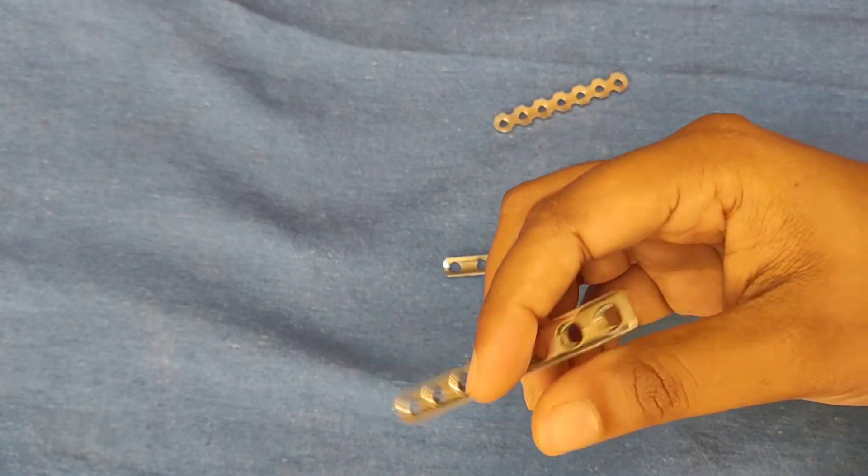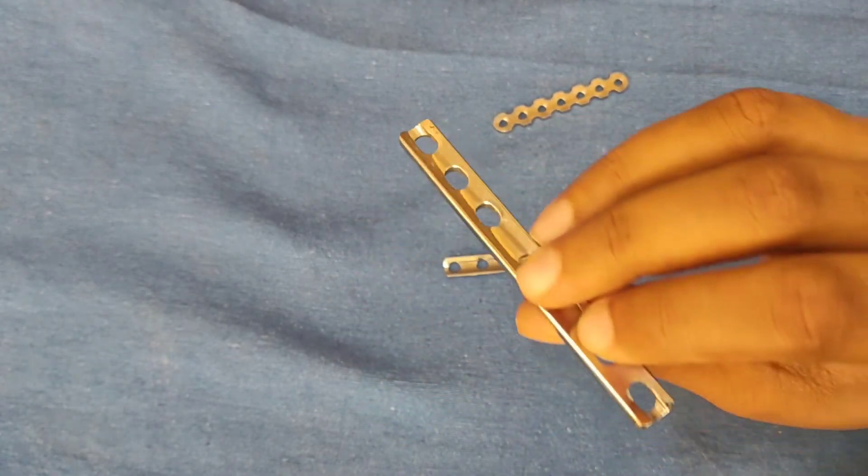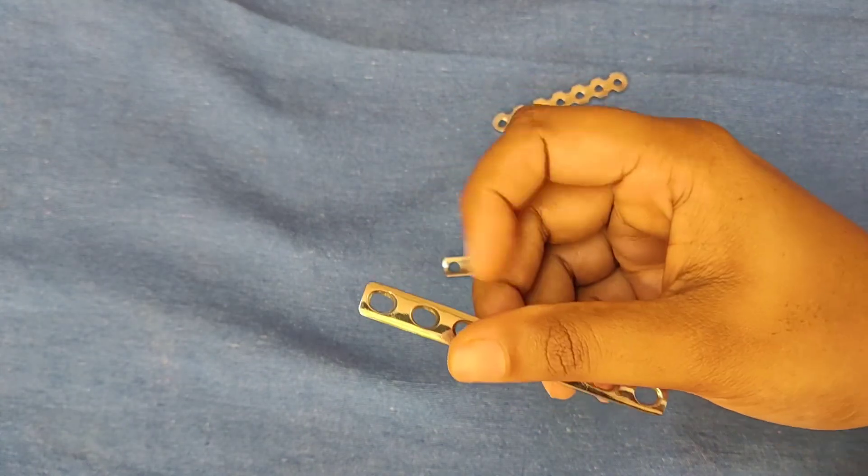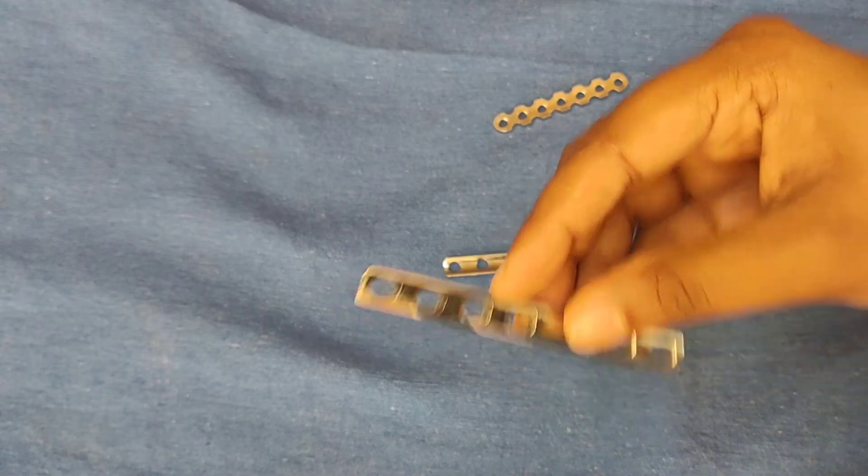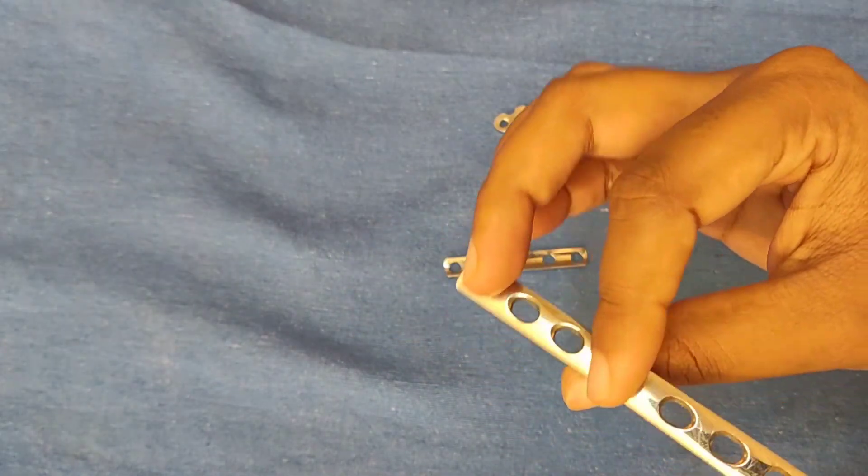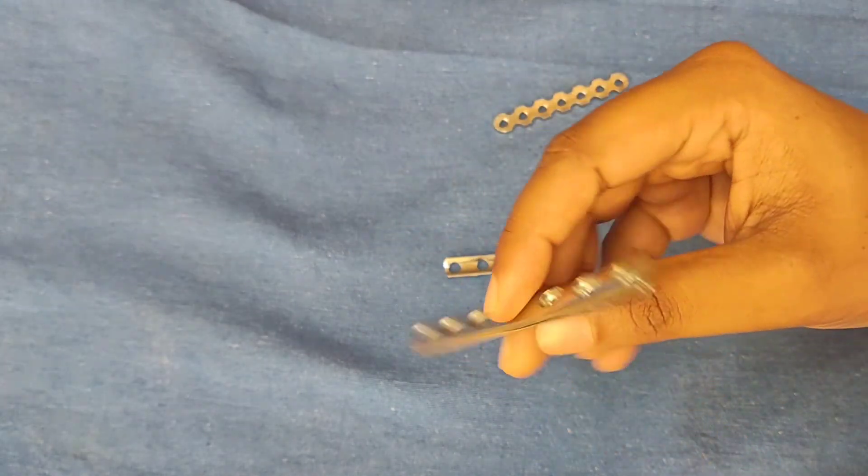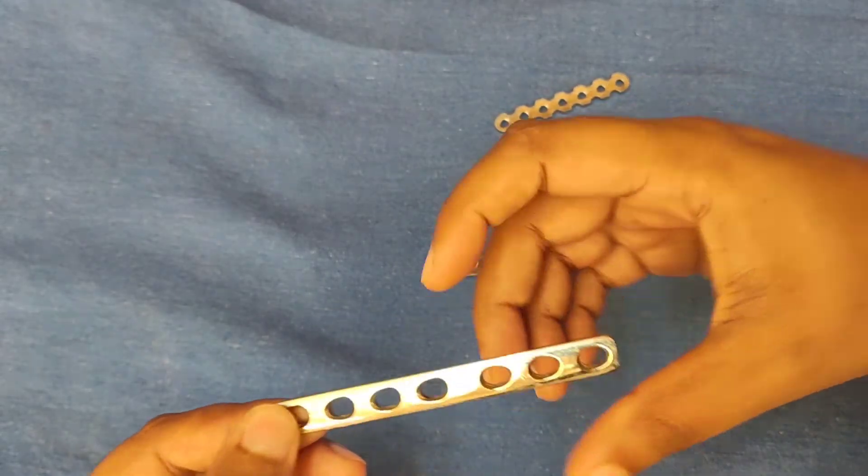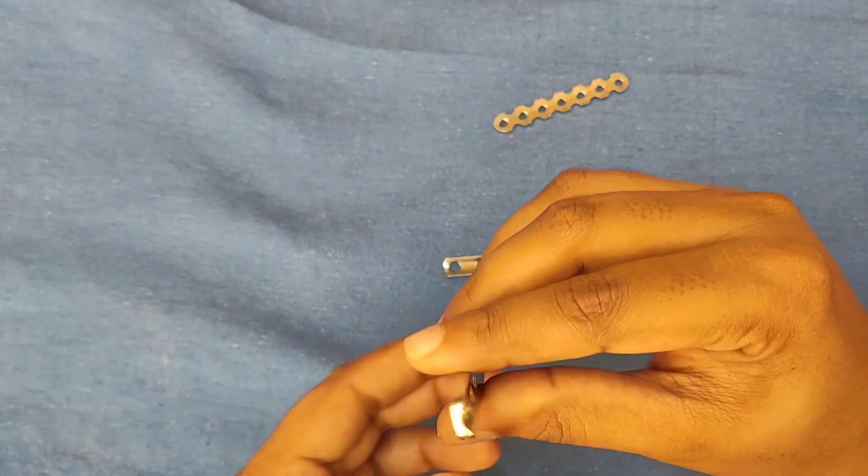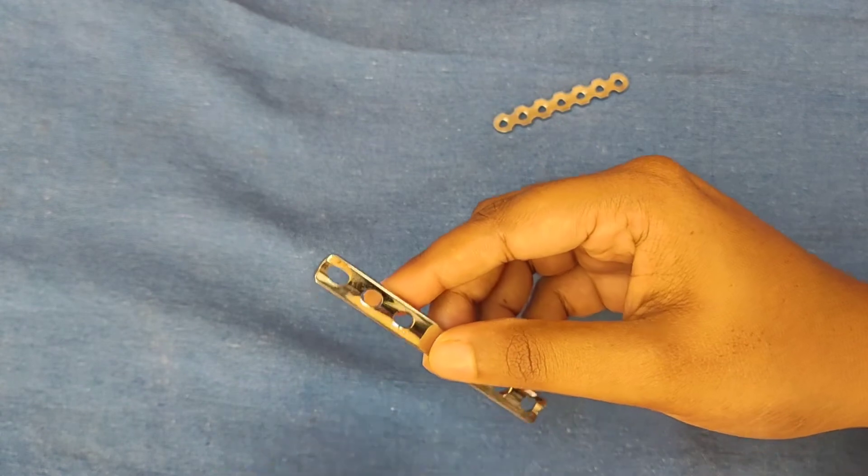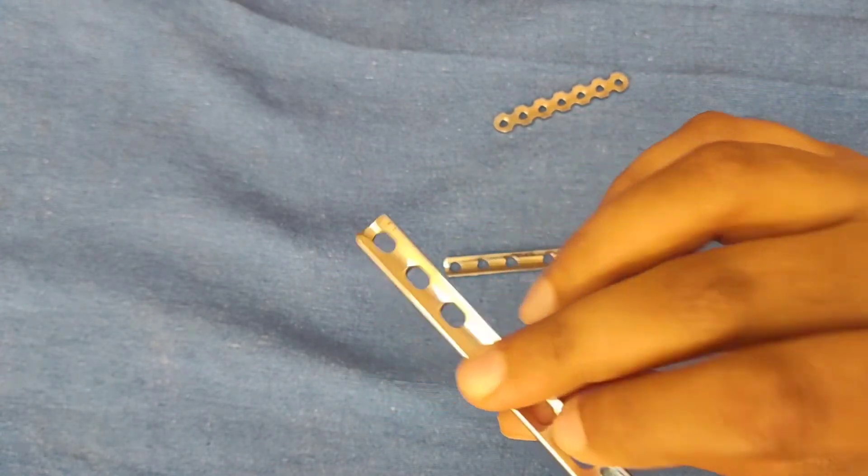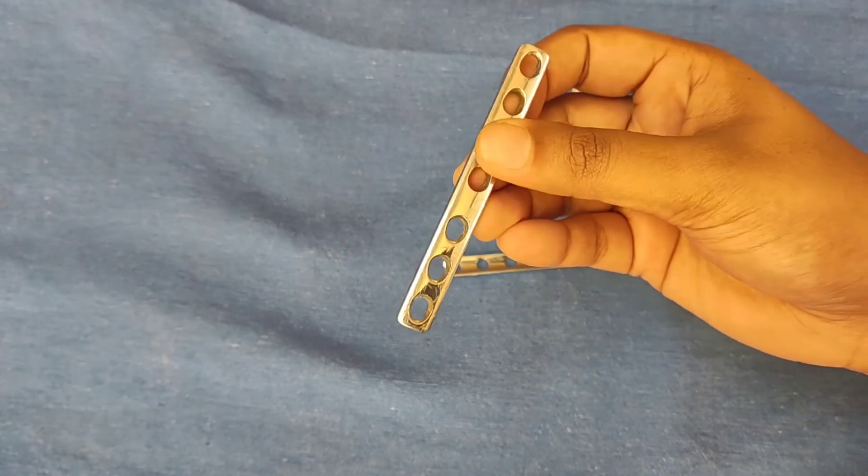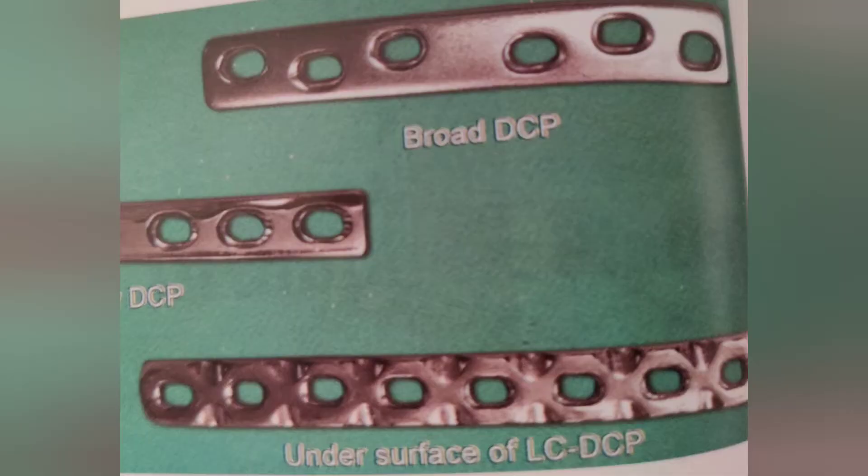An LCDCP or limited contact dynamic compression plate is a plate with undercuts and it has an even hole distance and an even distribution of bending force. It will minimally affect the blood supply of bone because it has an undercut and will not disturb the periosteal blood supply. The magnitude of compression will be more in an LCDCP than a DCP and bone ingrowth at the fracture site will be more in limited contact plate.